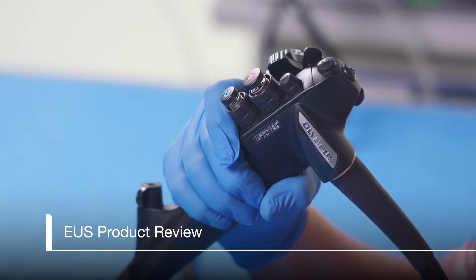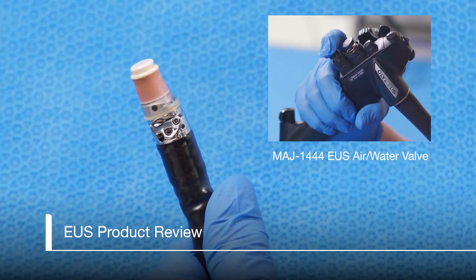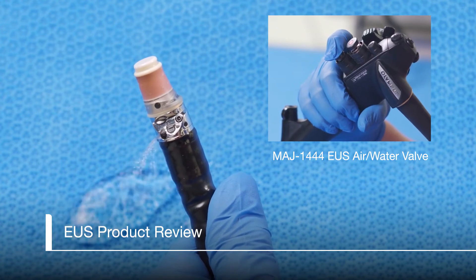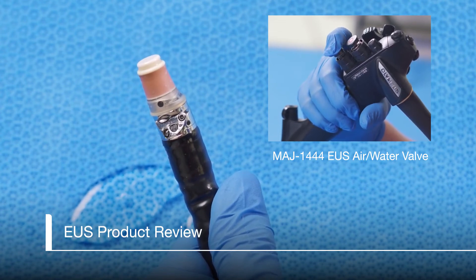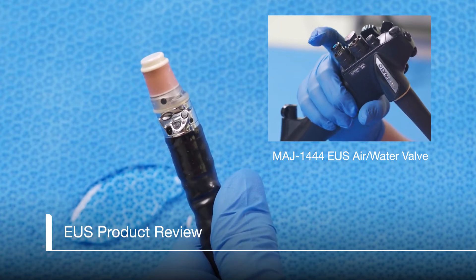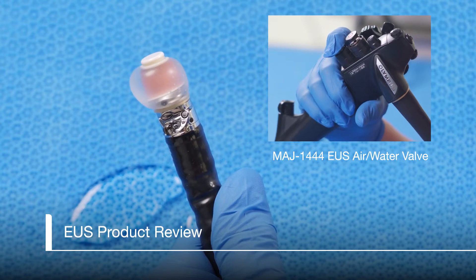For the MAJ1444 Air Water Valve, holding your finger over the hole in the center of the button and pressing halfway down to the first stage will activate the water jet to clean the lens. To dry the lens, release the button and cover the hole in the center of the button with your finger to allow air to be emitted. Covering the hole and completely pressing on the button to the second stage will fill the balloon with water.